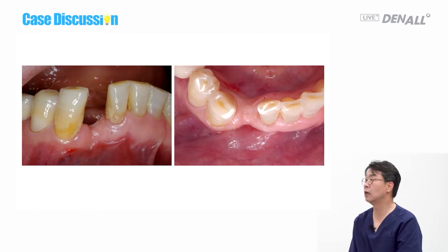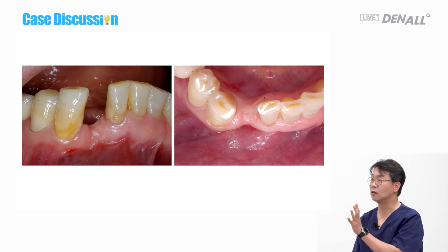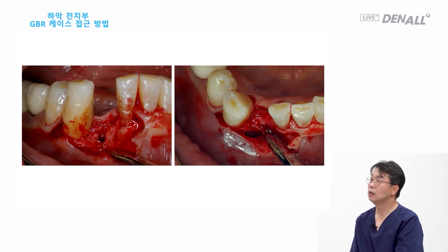If you insist on placing an implant in such a narrow ridge, I had a similar case. Compared to the previous patient, the area is wider. It looks wider. The opposite side, 42, but if you open it, it looks narrower than expected. So the dehiscence defect is bound to happen. So as I see it, the most difficult part in lower anterior is accurate positioning.